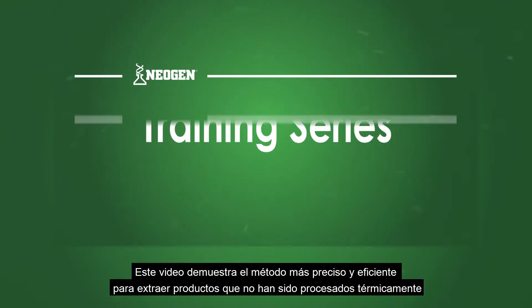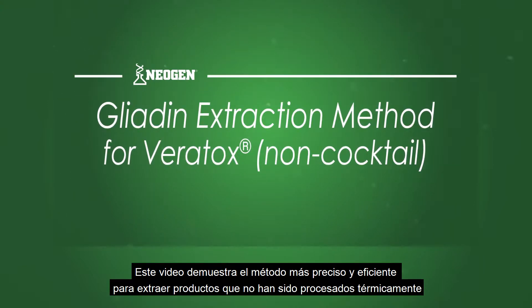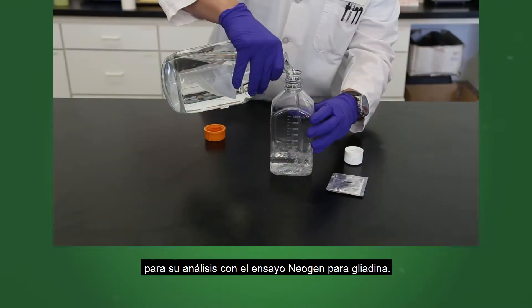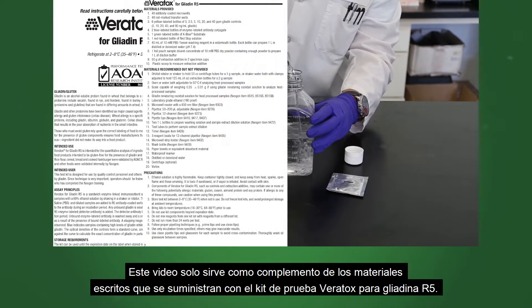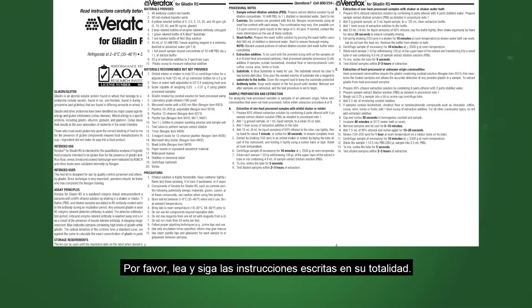This video demonstrates the most accurate and efficient method of extracting commodities that have not been heat processed for analysis on Neogen's Gliadin R5 assay. This video serves only as a companion to the written materials supplied with the Veritox for Gliadin R5 test kit. Please read and follow the written instructions in their entirety.